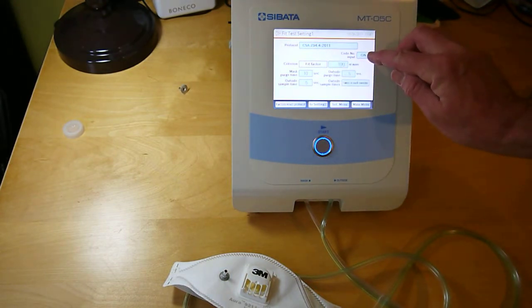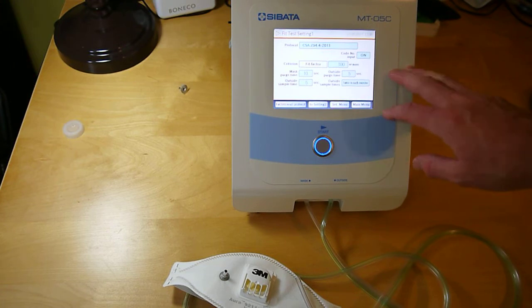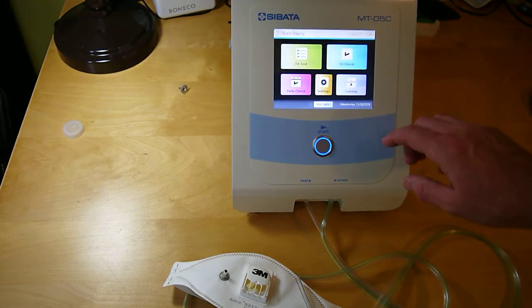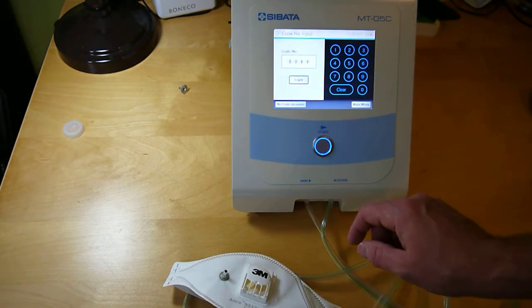You can turn on the code number input or turn it off. The unit can record up to 200 fit tests, and if you have it turned on, it will ask for an employee code to match the results to the employee. Go back to fit test.